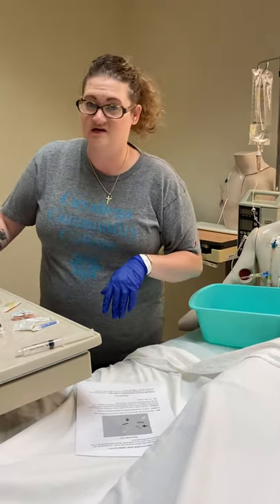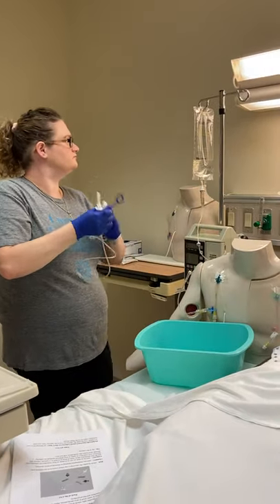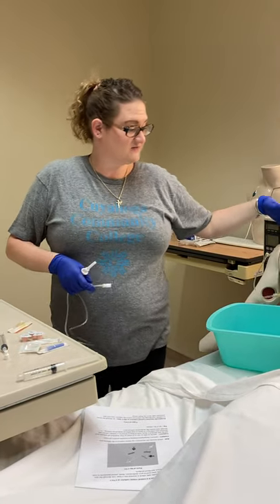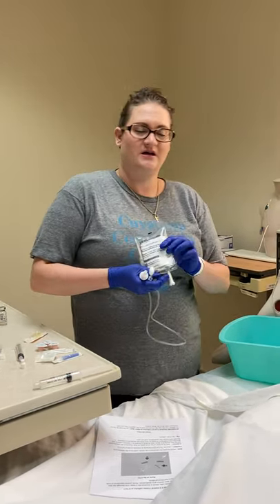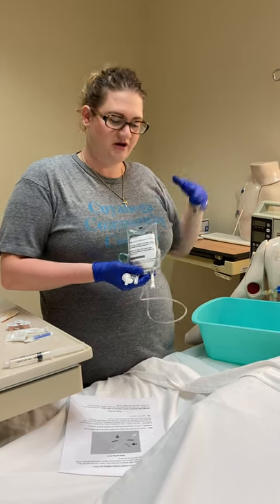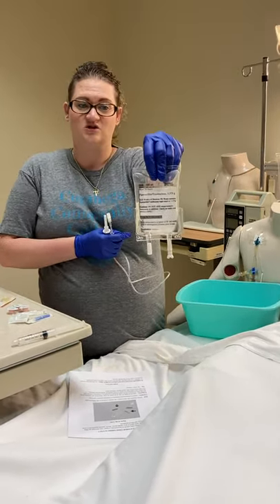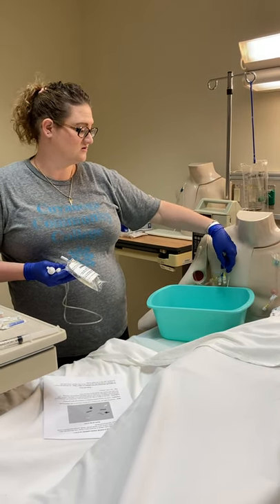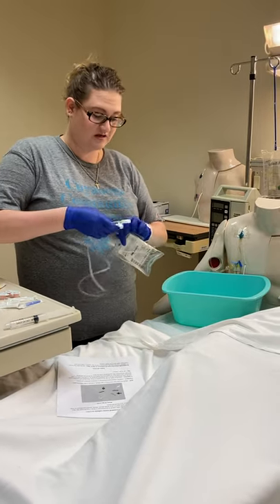For a piggyback, as long as it is compatible you're going to use secondary tubing and can back prime. If it's not compatible — especially with central lines that have more than one lumen — the beautiful thing is you can use a separate lumen. Say my Zofran or Zosyn is not compatible with my IV fluids because maybe there are additional electrolytes added in a higher concentration. I can use a primary line, attach my Zosyn, select a different port, and run it as a primary line through that separate lumen. That's the beauty of these central lines. Zosyn is compatible with saline, so we'll proceed with that.